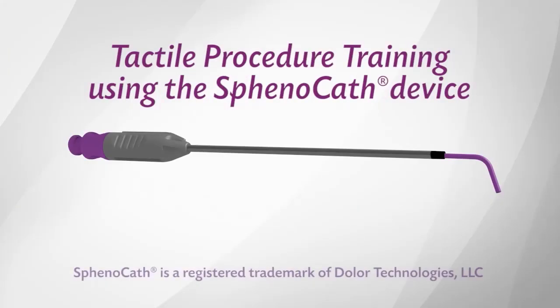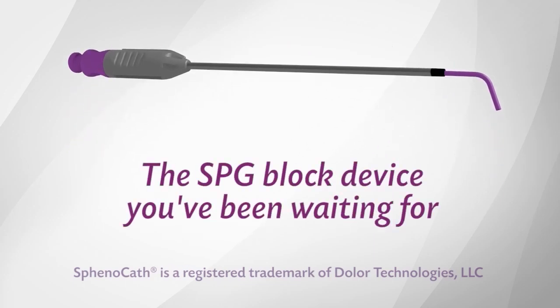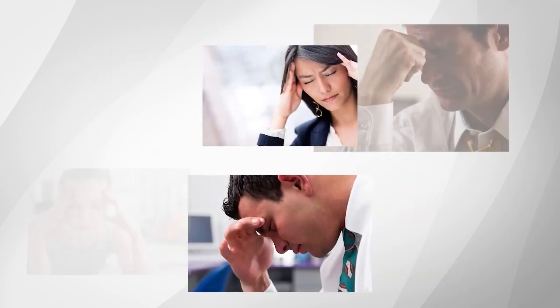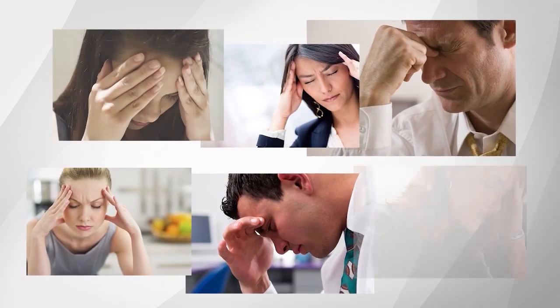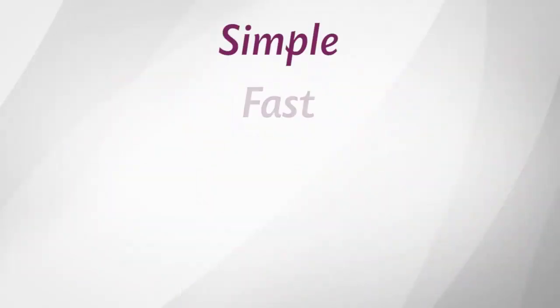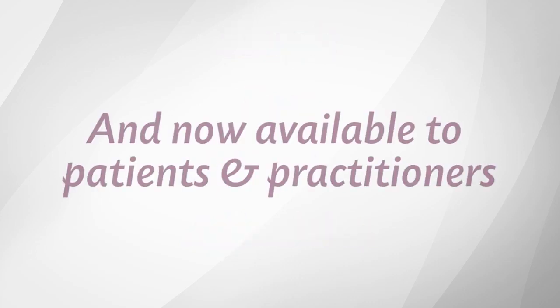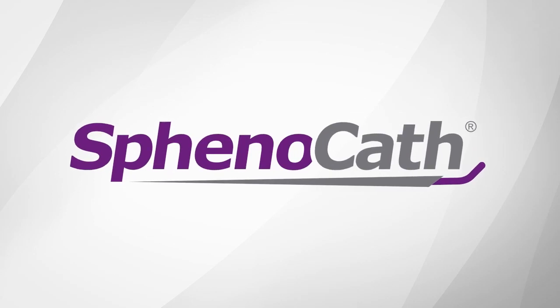Sphenopalatine Ganglion (SPG) blockade has been utilized for decades in treating various types of headache and facial pain syndromes, sometimes yielding promising outcomes, but unfortunately, frequently resulting in failed treatment results. However, providing this procedure in a simple, fast, effective, and affordable manner has been difficult to achieve. The SphenoCath addresses all of these challenges.